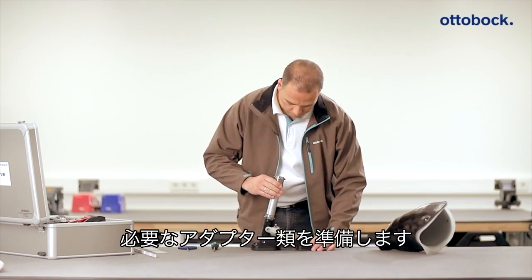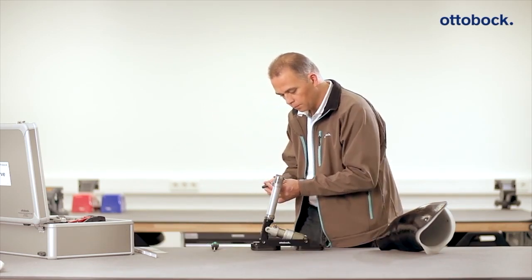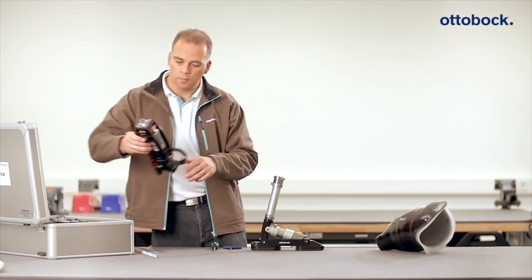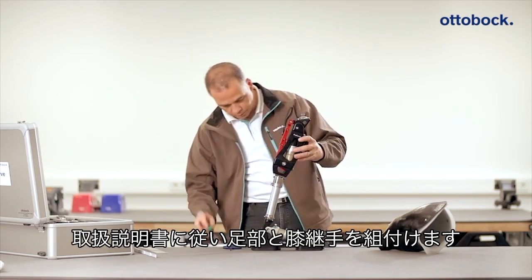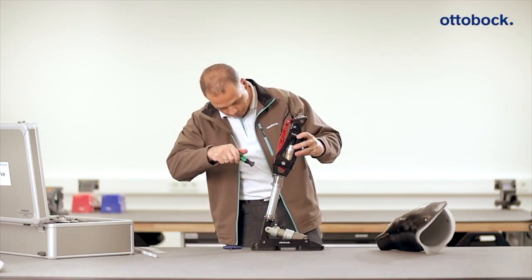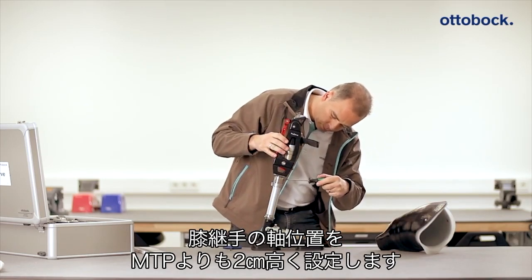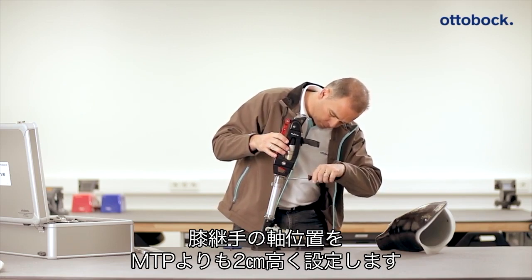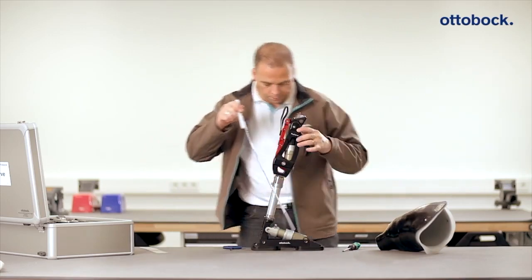Remove the required adapter from the testing case in order to connect the ProCarve prosthetic foot to the ProCarve prosthetic knee joint. Attach the prosthetic knee joint according to the instructions for use. Position the alignment reference point — the axis of rotation of the knee joint — at the height of the medial tibial plateau to floor measurement determined for the patient beforehand, plus 20 mm.